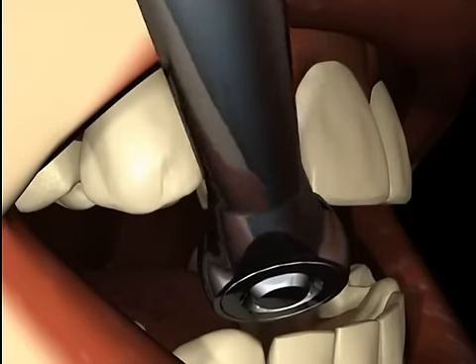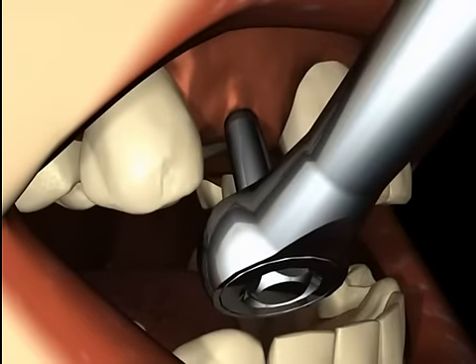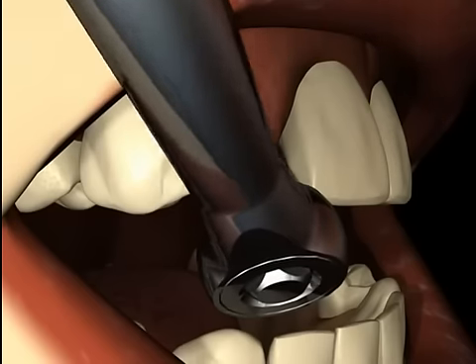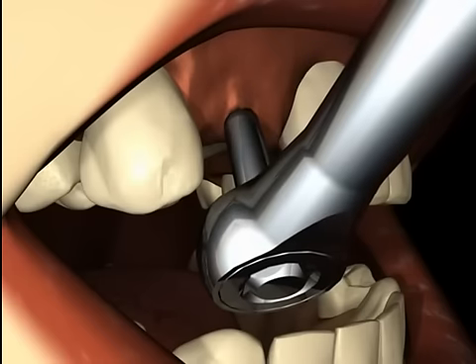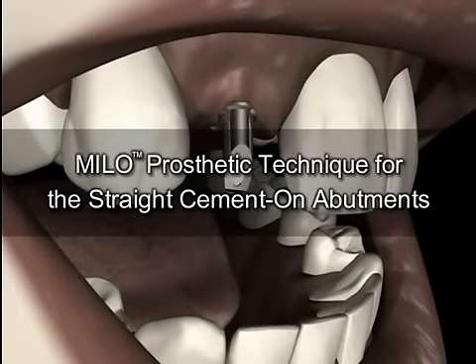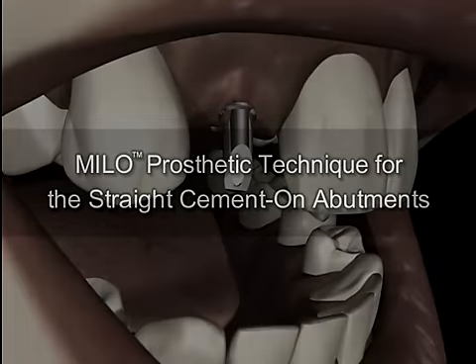At this point, the implant is securely in place. The gingival collar is in its proper relationship with the soft tissue, and the O-ball abutment is at its correct height. Once the placement of the implant has been accomplished, the prosthetic component of choice is now ready for use. In this instance, the final restoration will be made using the MILO straight cementable abutment.